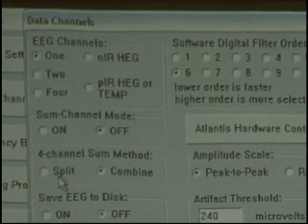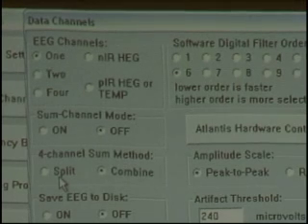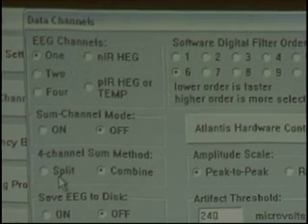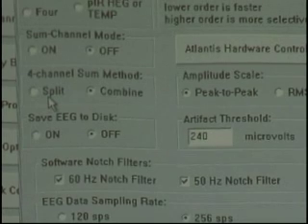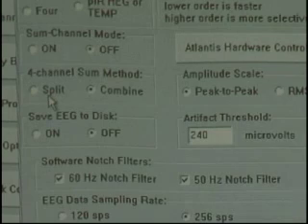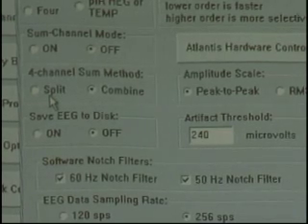When we turn sum channel mode on, with four channels, we have another question to answer: do we want split or combine sum channel mode? The difference is — combine is channel one plus channel two plus channel three plus channel four, versus split is one plus two and then three plus four. If we're using one channel, it really doesn't matter what we put here. The four channel sum mode never matters unless you're in four channel mode and sum channel is on. It would be really great if it was grayed out unless it was applicable — when priorities lessen for other features, we'll get some of these little things taken care of so that the four channel sum mode only appears when it's relevant.